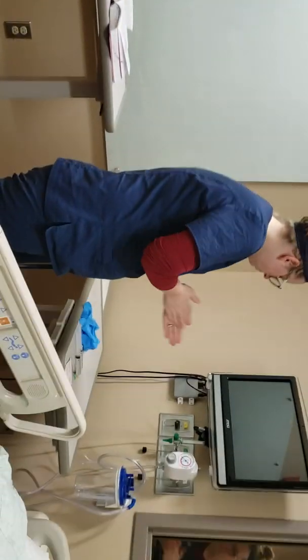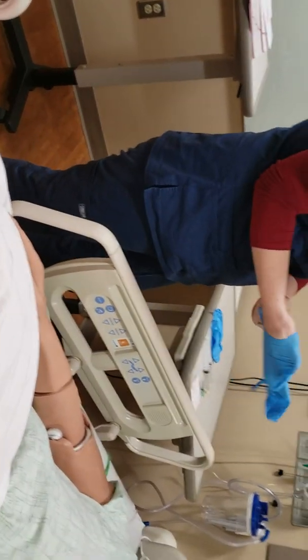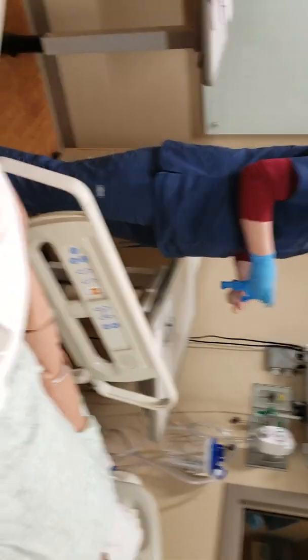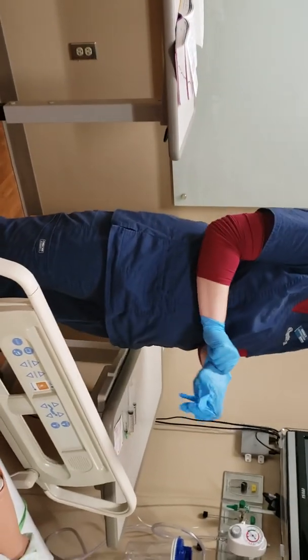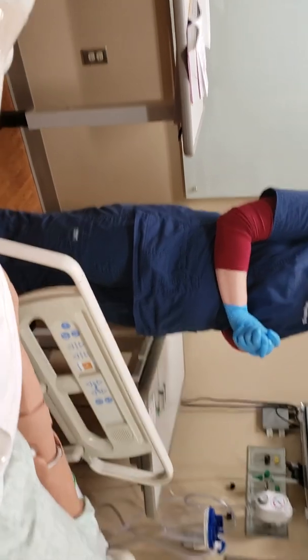Wash my hands and apply my gloves. I have prepared her drugs in her room, so she was always in my sight and did not exit the room.